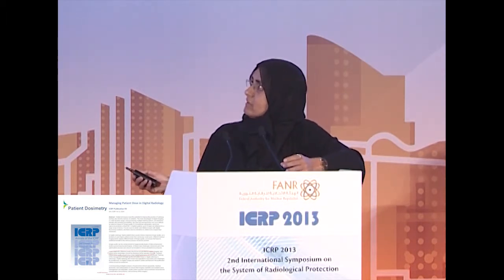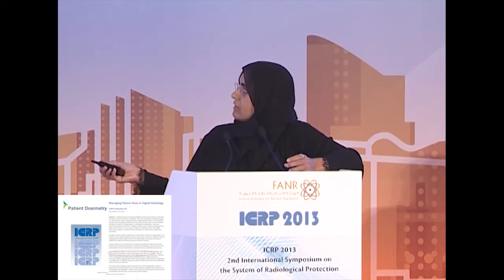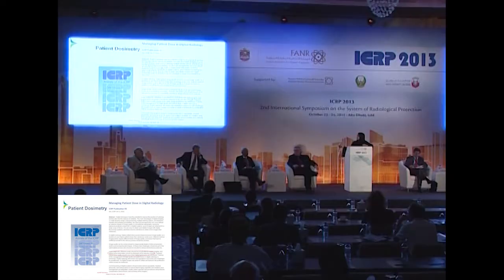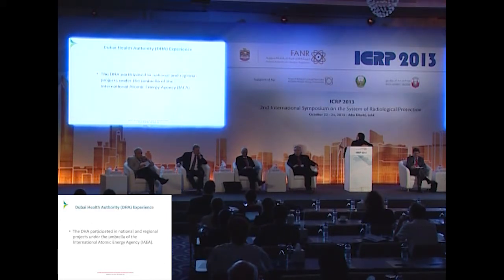ICRP publication number 93 emphasized re-evaluating digital imaging, and also showing the doses on the console. This is very important to keep a record of patient doses. The IAEA also mentioned that the frequency of examinations needs to be looked at too, because with digital radiology it's easy to perform the procedures.